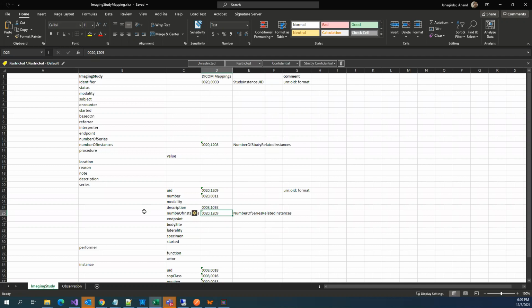Okay. So now let's assume that we are done with the study and the observation, and we put up an application in front of it. So if the application wants to access any of those tags or anything, I mean the real image behind that, so they will establish a route to the PACS, is it? Yeah, that is where this endpoint will come into the picture. You see, this endpoint is the one where it will put this link.